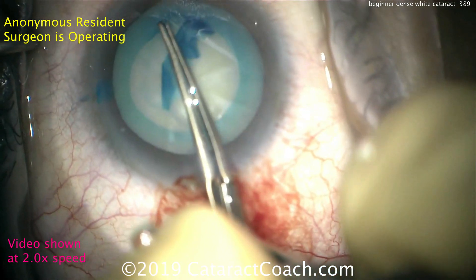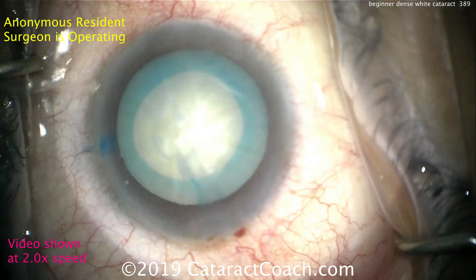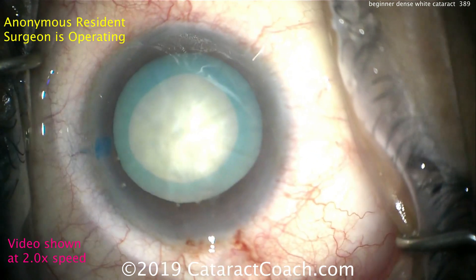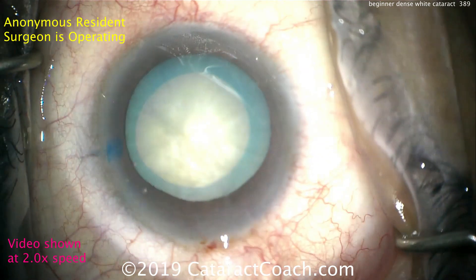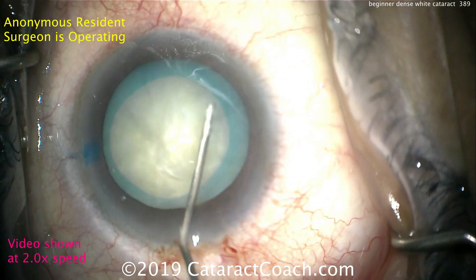This is a beginning surgeon who has done less than 50 cases. That's a beautiful rexis — I like that a lot. Incisions look pretty reasonable too. We didn't get to see the surgeon make them, but that's okay. Now a little bit of hydrodissection. Be very careful with the white cataract because you can't see the fluid wave, so a little bit in each quarter. That looks like a good maneuver.